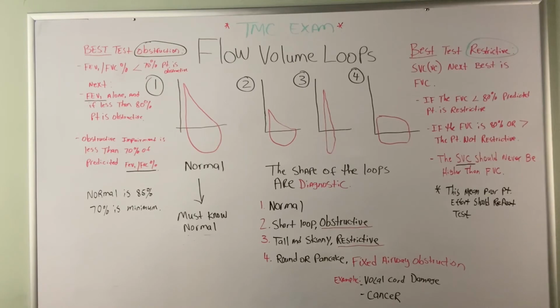What I'm showing you tonight and what I'm doing in my video is giving you the very essential things that I know you will see on the TMC exam. You will see all of these flow volume loops. You need to be able to interpret them. You need to be able to recognize them, because when you recognize them, then you recognize a diagnostic process with your patient, and you have to treat the patient accordingly.